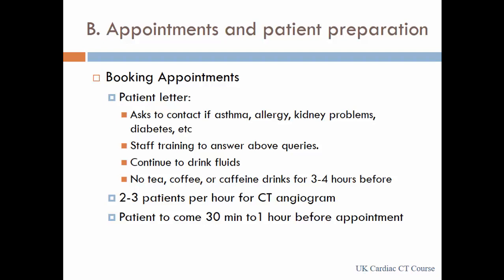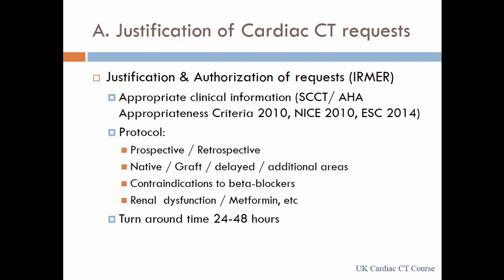If we are giving oral beta blockers, then we ask them to come an hour before. If we're giving intravenous, then they can come 20 minutes to half an hour before the actual appointment time.